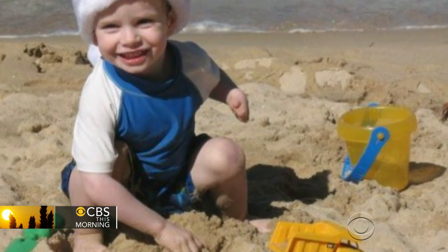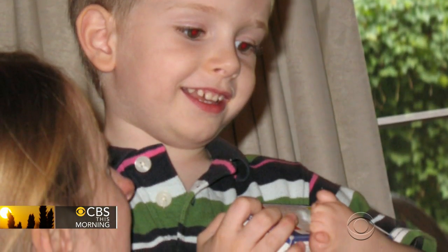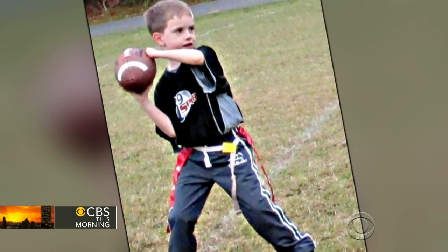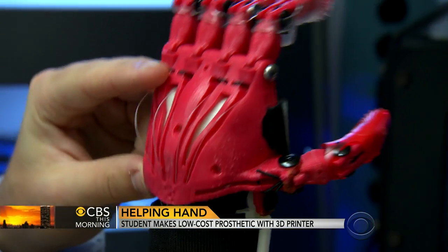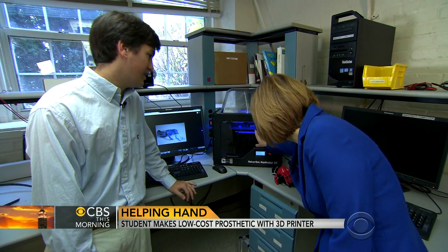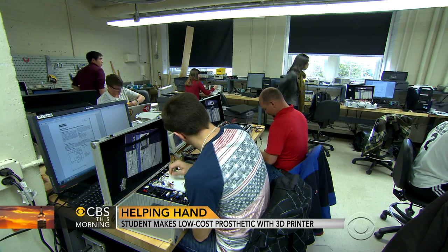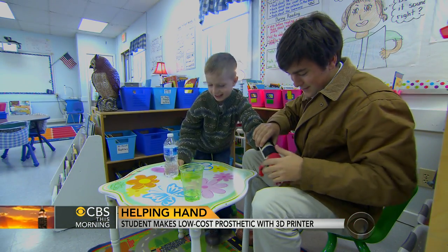Children like Holden, born without hands or fingers — in his case, the fingers on his left hand — often require custom prosthetic replacements costing thousands of dollars. But this inexpensive device was created by a college student using a 3D printer; it builds it layer by layer. Senior Jeff Powell studies biomedical engineering at the University of North Carolina at Chapel Hill. He took on the project after learning about Holden from one of his professors.